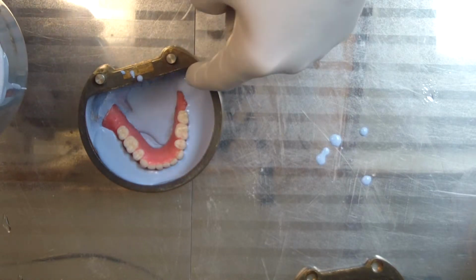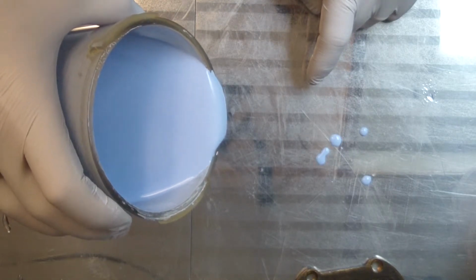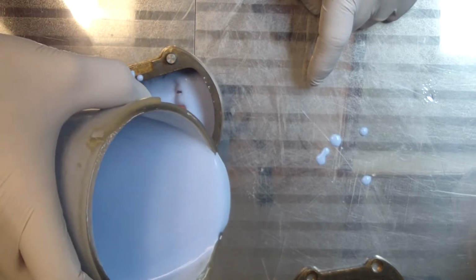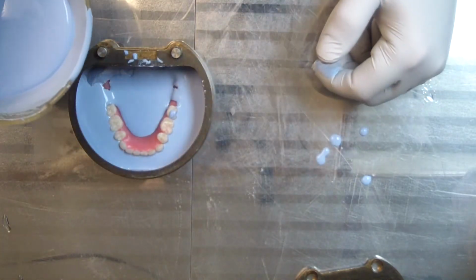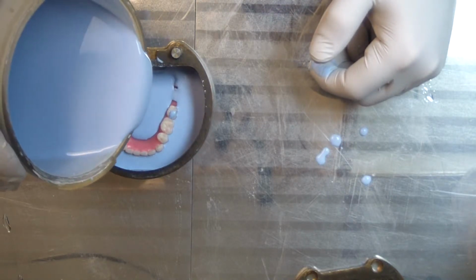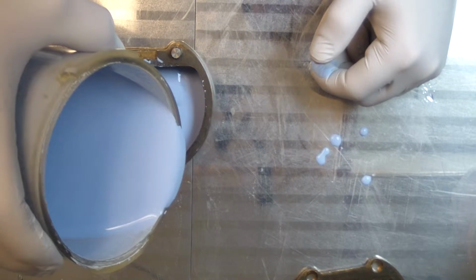Okay, so I go from the distal all the way around to the other distal, and I can move my container slowly all the way around until the facials of the teeth are fully engulfed in stone, kind of like this. Okay, this way I know that it kind of creates a nice seal everywhere and I'm not trapping any air. And then I go from the lingual and you go slowly again. From posterior to anterior.